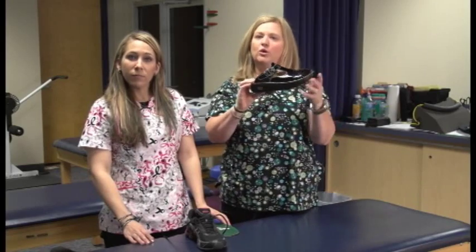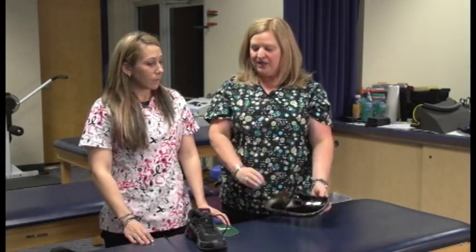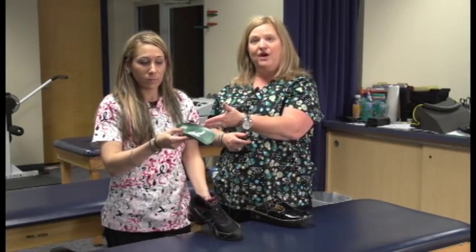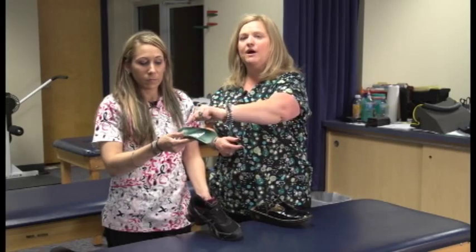It will help to hold the normal shape of the foot while you're walking. The shoe that Dr. Schultz has is actually a gym shoe, so we're going to put in a specially made orthotic for a gym shoe that has a heel cup in it, and that's going to prevent side to side sliding when you're working out at the gym or walking or running.